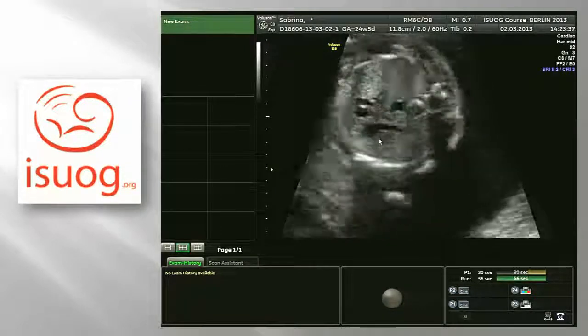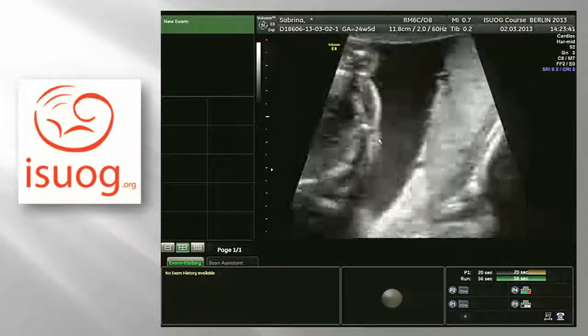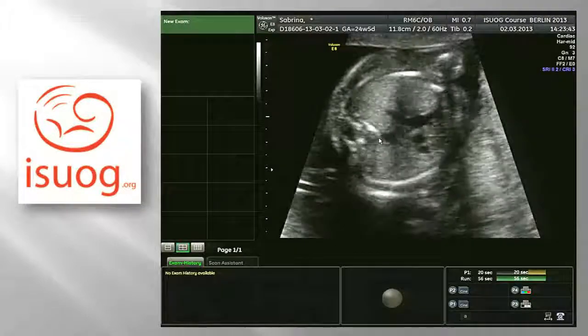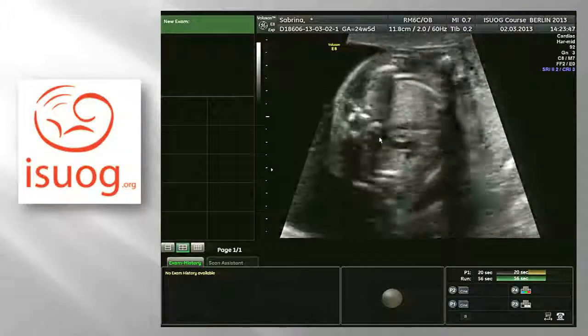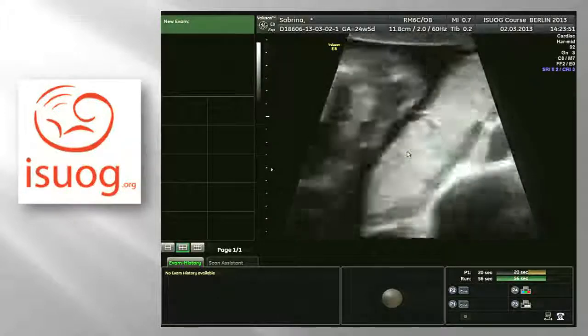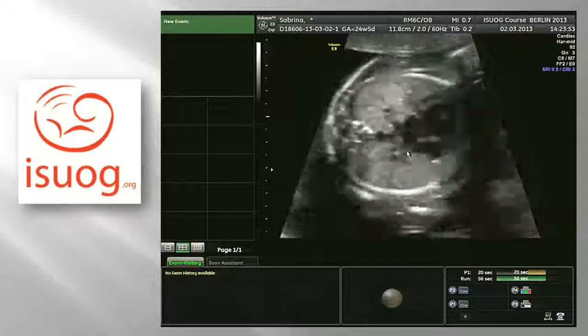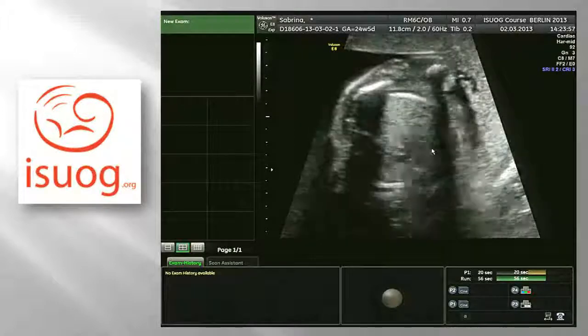And when I go with a transducer... This is called a live demo, not a video demo. This is why it should be so live.